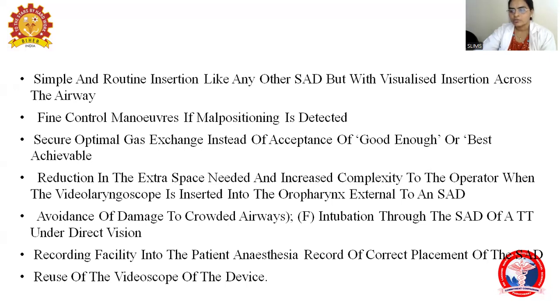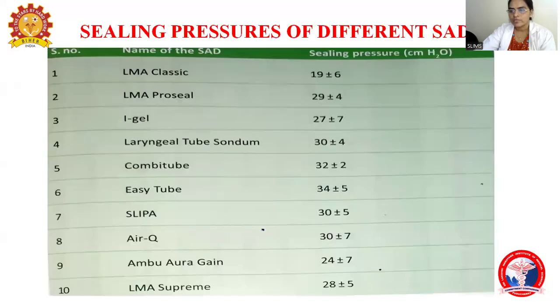Intubation through the supraglottic airway device under direct vision, and a recording facility in the patient anesthesia record of correct placement of the supraglottic airway device. There will be a reuse of the videoscope of the device.